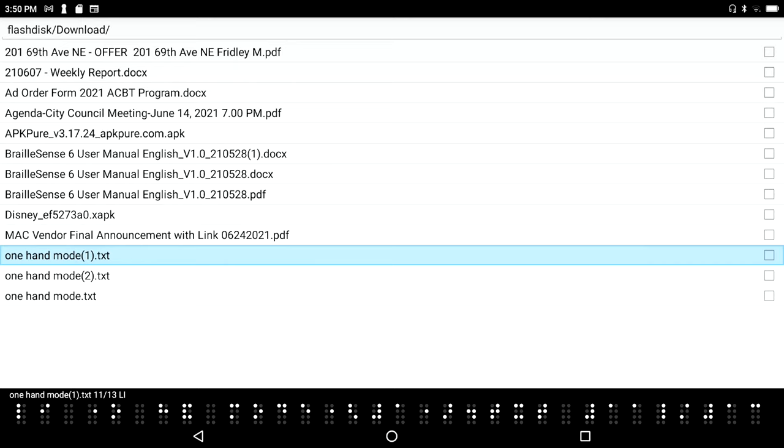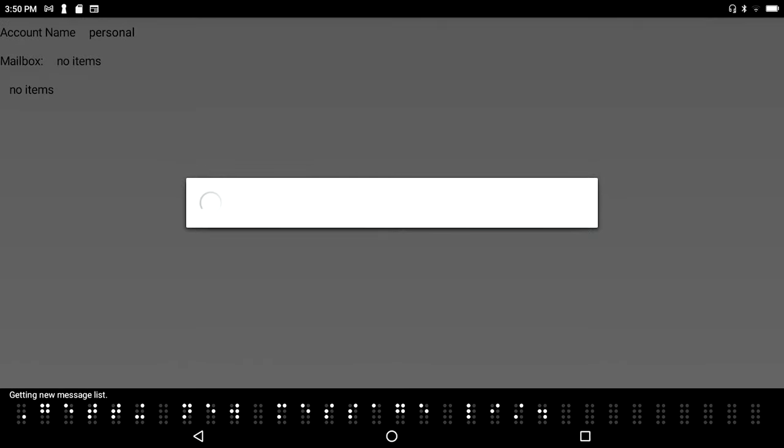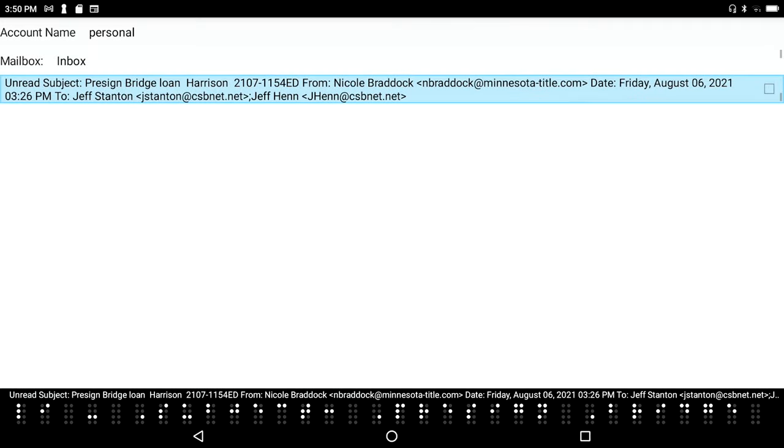So right from the main menu where I am now, I'm going to press the letter E, and I'm going to press W to get into a new message - W for write.